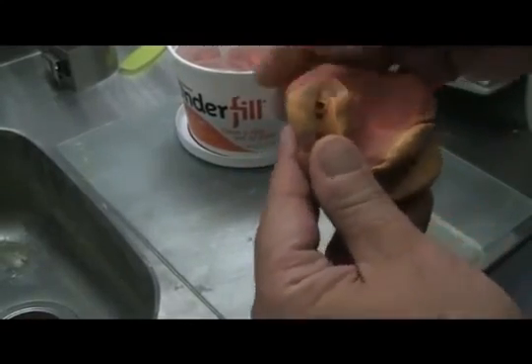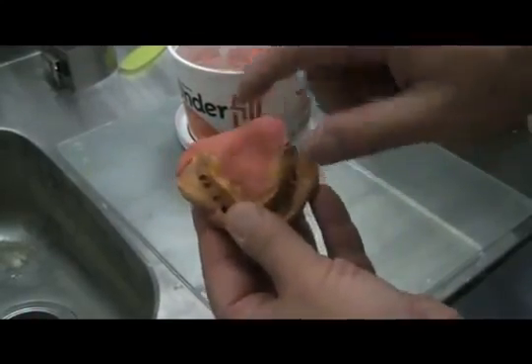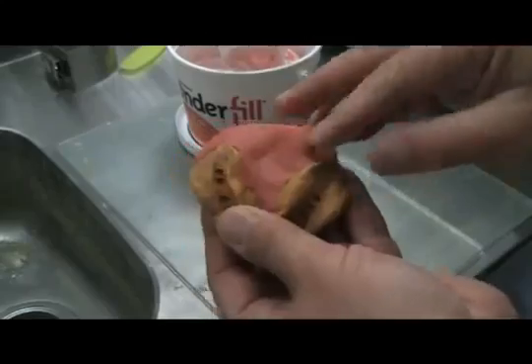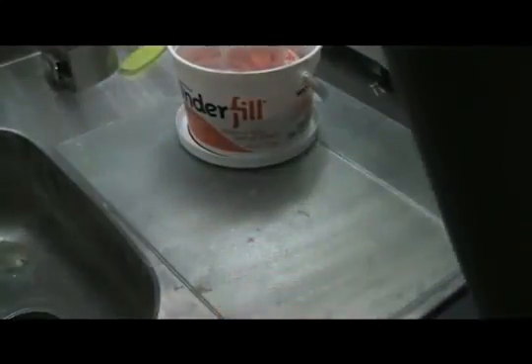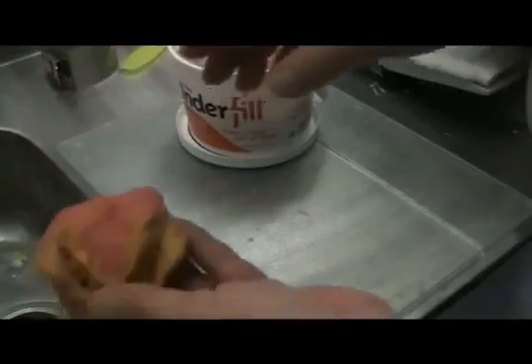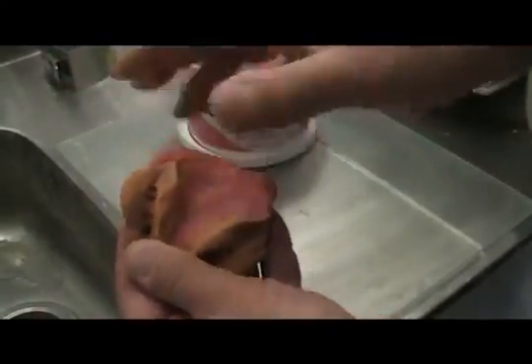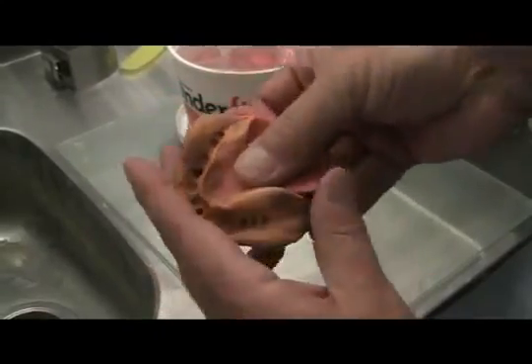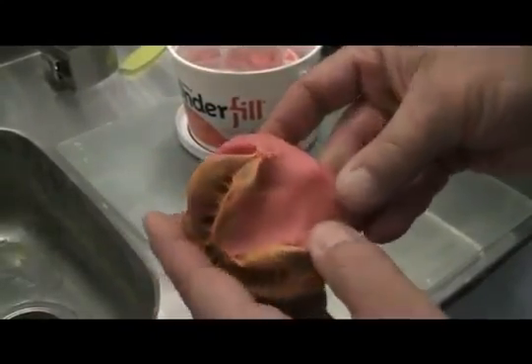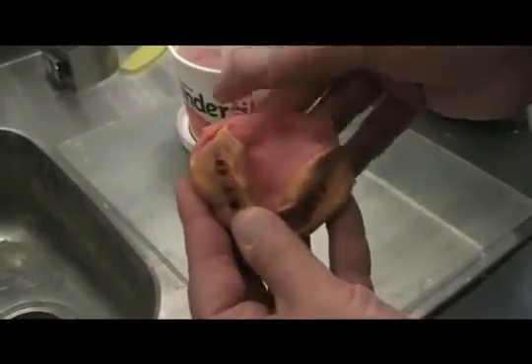And once I have it all filled and formed, I can pour an impression up, and it will not fill the tongue area. The tongue area will be totally blocked out. You can also use a little water. I could turn a little water on just for a second, and because it's water soluble, you can smooth it to just about any contour that you want. And again, the nice thing is that it takes just seconds really to get it formed, and you'll see it fills very nicely.